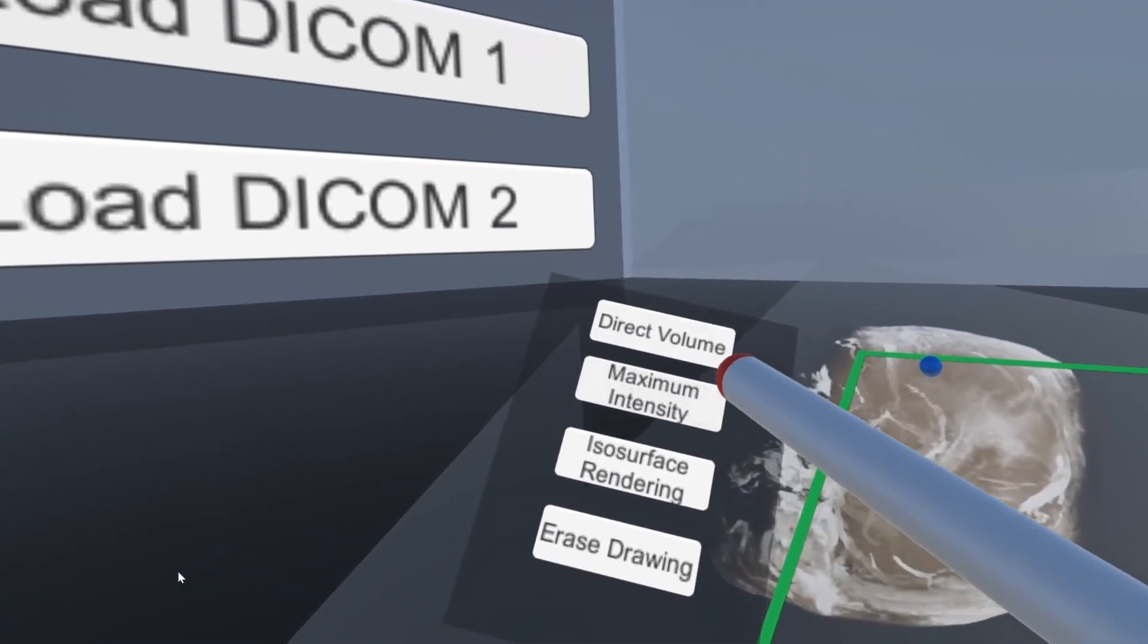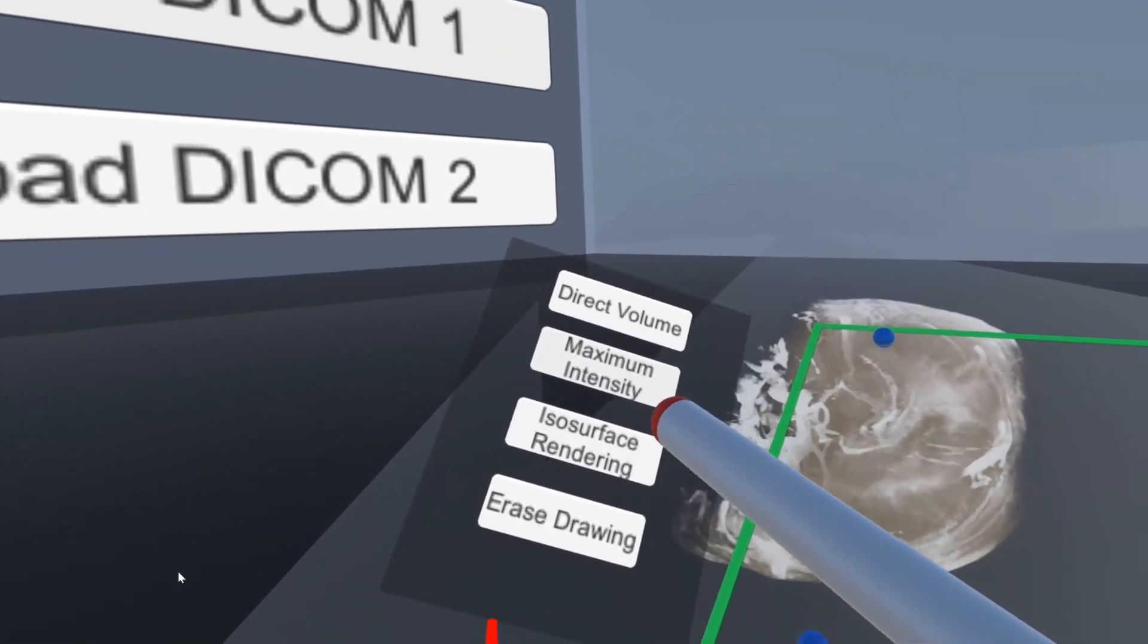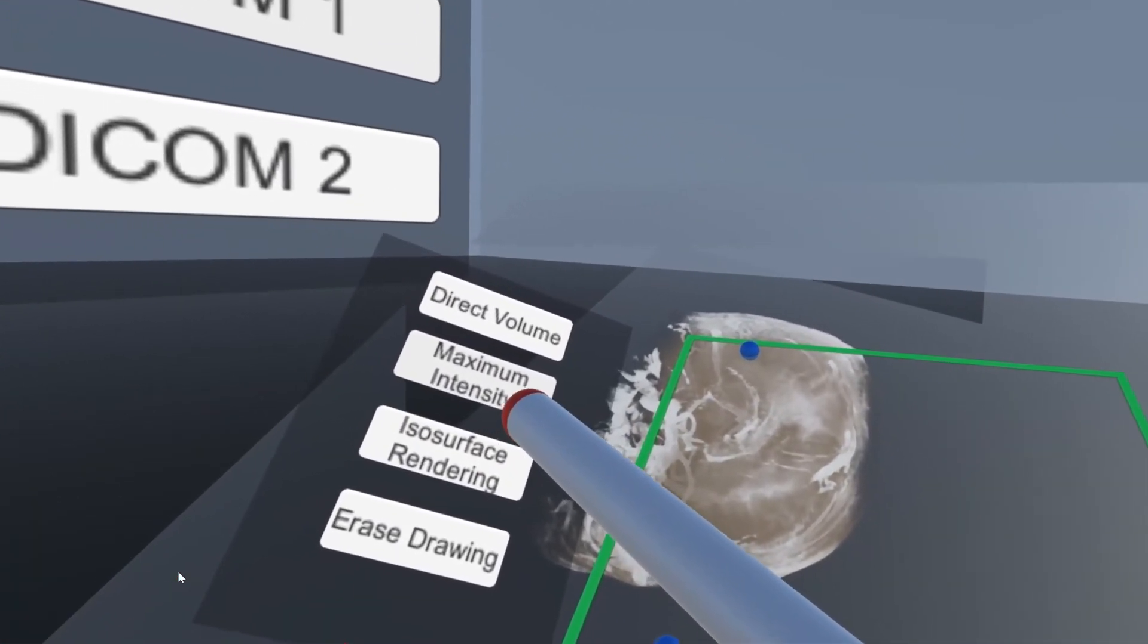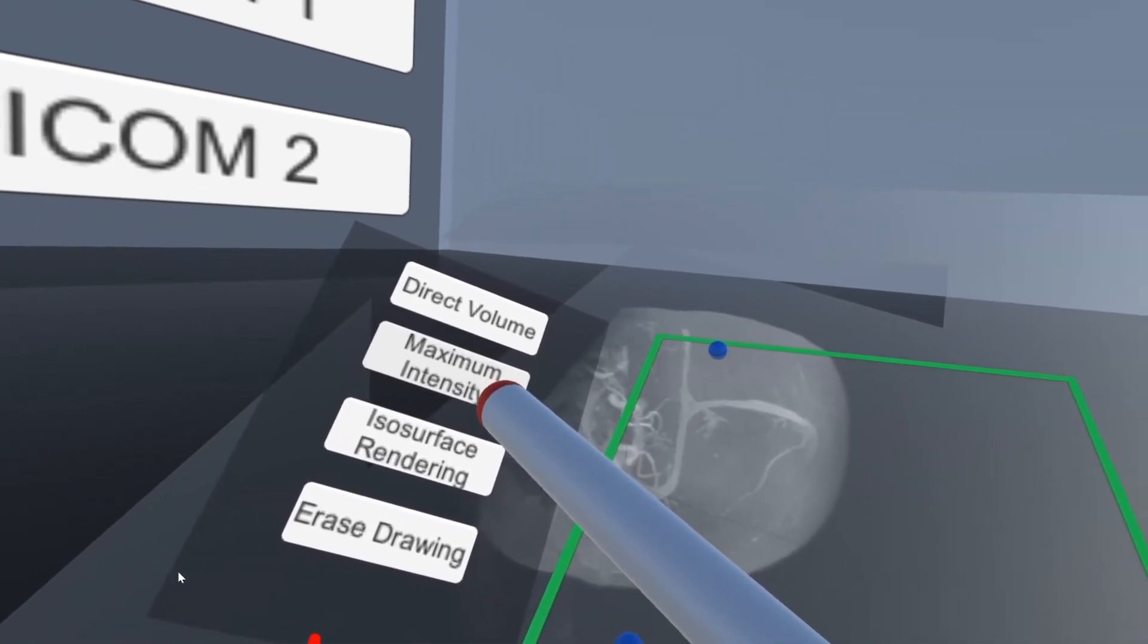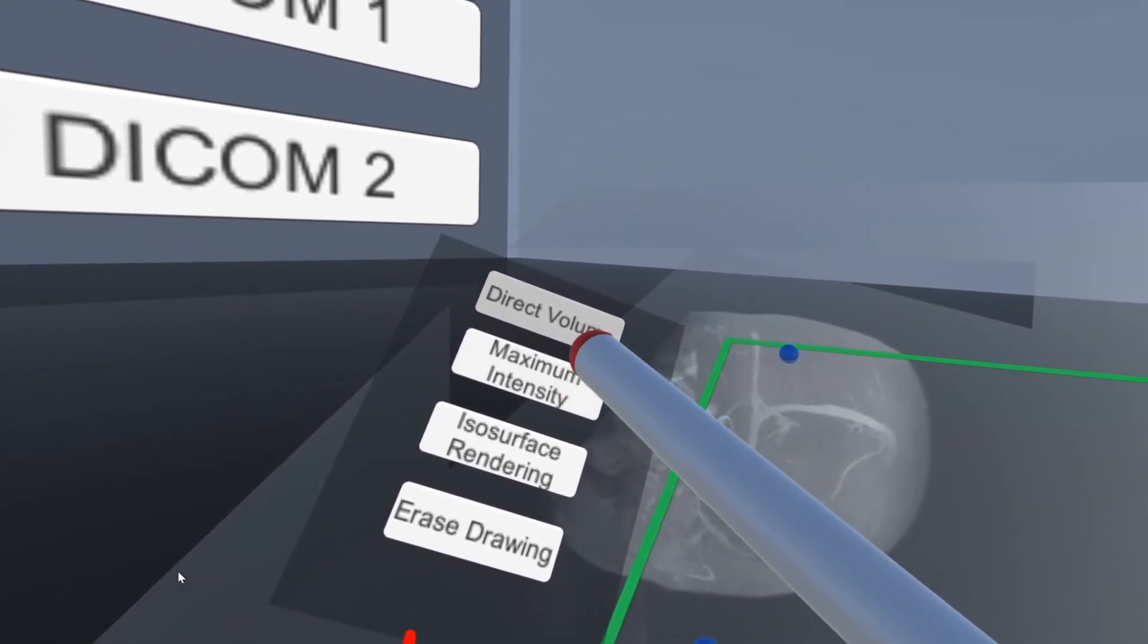And we also have three different rendering methods here to be able to get a better view of the scan.